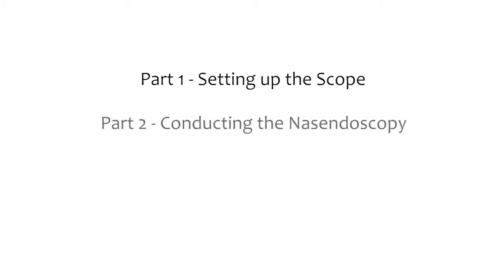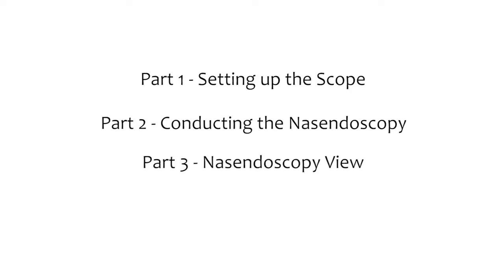This nasendoscopy video is a resource that we'd like any anaesthetist to use to learn the skill. The video will be in three parts basically. So the first part is about the setup of the scope and the equipment itself, and then there'll be two videos on the scope being performed, both how it looks and what the actual user of the scope sees as it passes through the airway.